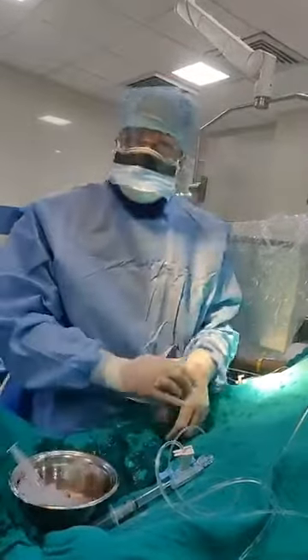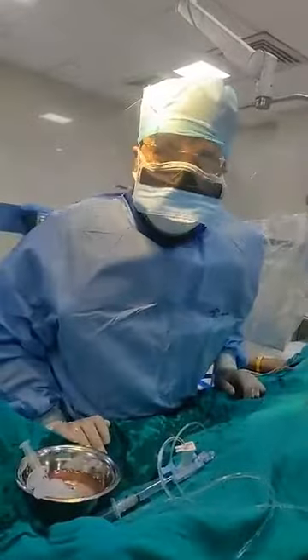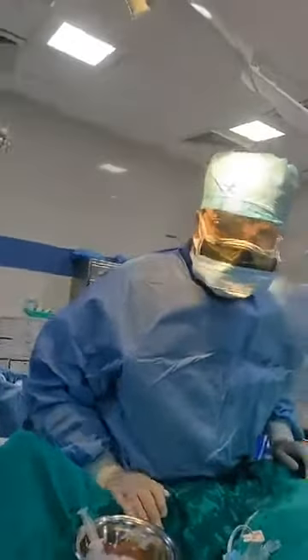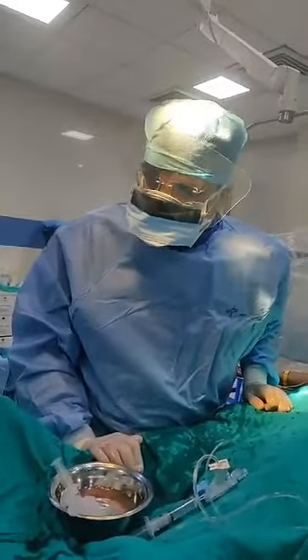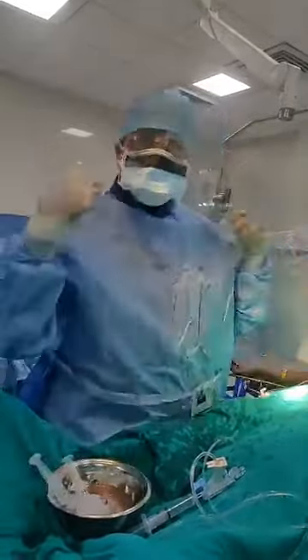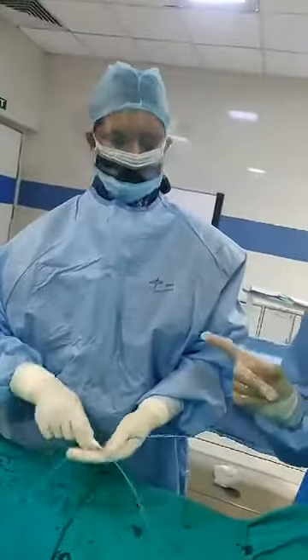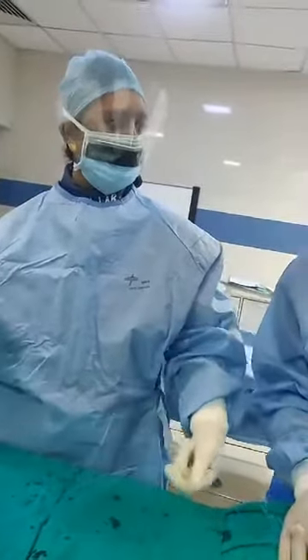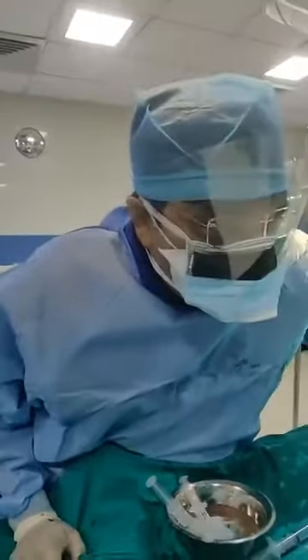A lot of people have a lot of fear about angiography, so I want to show how simple this procedure is. The nurse is Madame Alina and the technician is Mr. Chandan. And myself Dr. Vivek Gupta from Apollo Hospital, and the nurse who is doing the recording is Madame Malita.